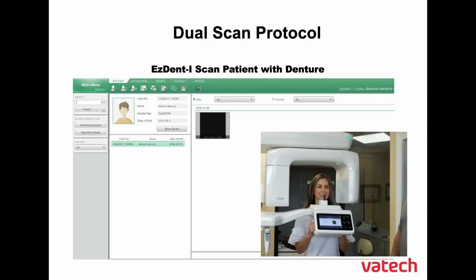Right, and I would say, Jim, maybe one thing, we scan it straight DICOM format. We don't use the model scan setting for that scan. Correct. All right.